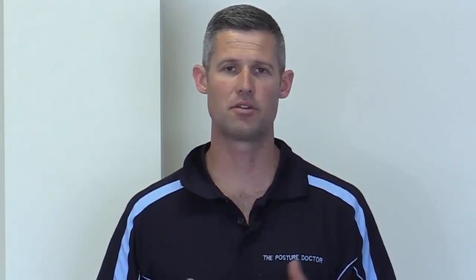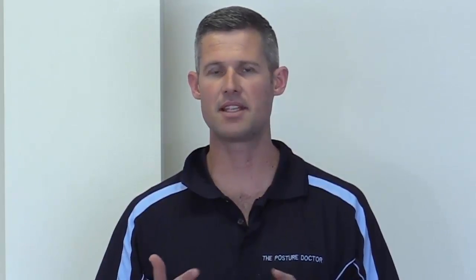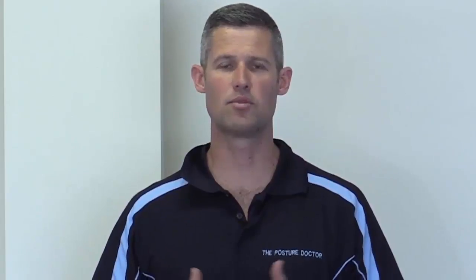When you are using the thoracic lift, we ask that you start off on 1 minute, and I'll show you how to get on and off the thoracic lift. Because your body has been stuck in a posture where the thorax is going backwards and the head is going forwards, muscles, ligaments and connective tissue have changed. So they're not going to be as flexible coming forwards.